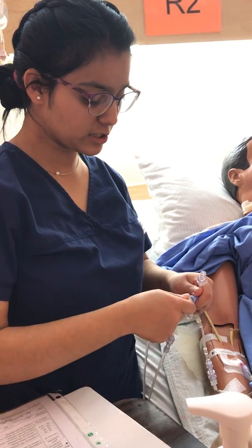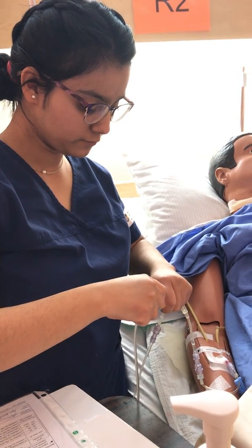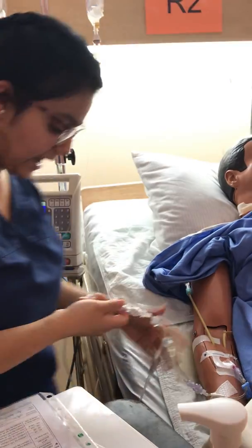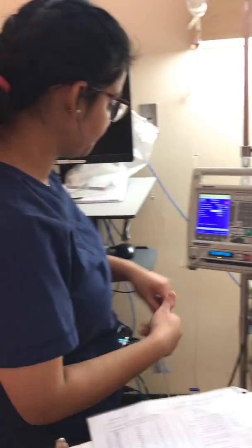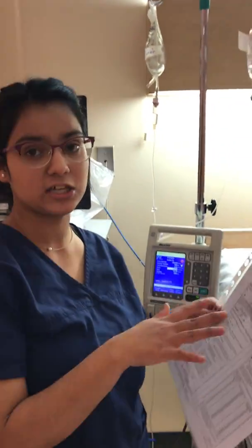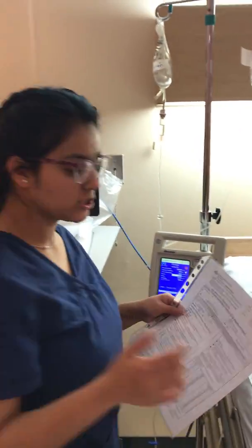Now I'm going to take this, make sure that I stay sterile. And we're going to connect. Once it's all connected and ready to go, I'm going to call my second nurse, and she's going to do the third check with me because it's a high alert medication. So my buddy nurse is here, so we're doing that.